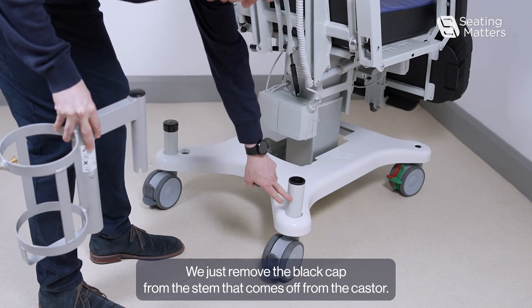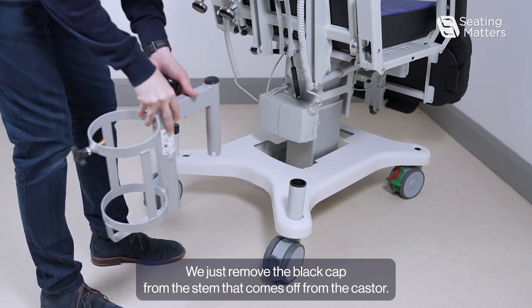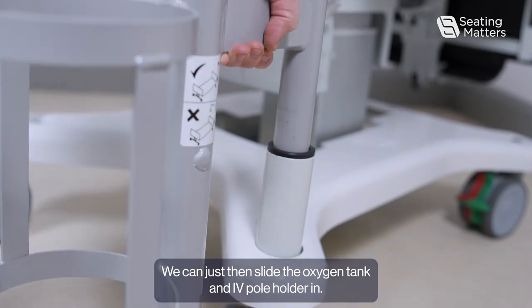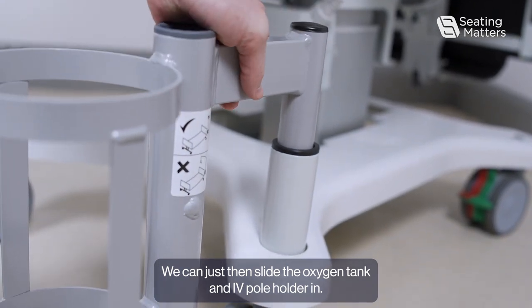We just remove the black cap from the stem that comes up from the caster. We can just then slide the oxygen tank and IV pole holder in.